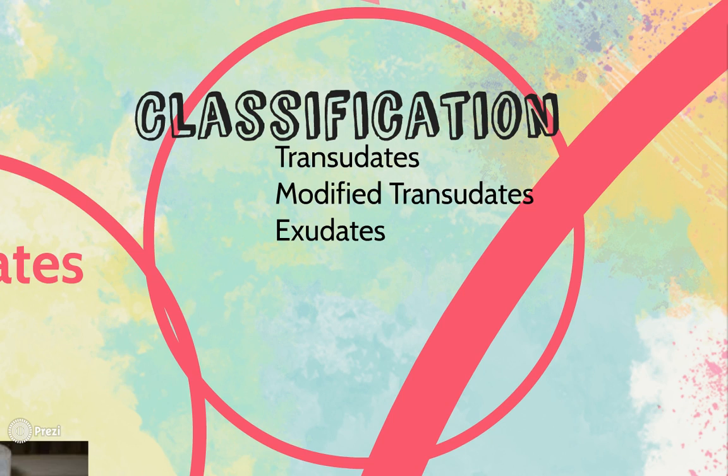criteria that you might want to look out for is the presence of bacteria in the abdomen or in the thorax, in any of those fluid, so the effusion samples. So for that, if bacteria is suspected or if a fungal organism is suspected, then definitely take some fluid, put it in a nice sterile red top tube, and send it. Have your veterinarian send it out for culture and sensitivity. And specifically, they could be looking for aerobic, anaerobic, fungal, mycoplasma, etc.